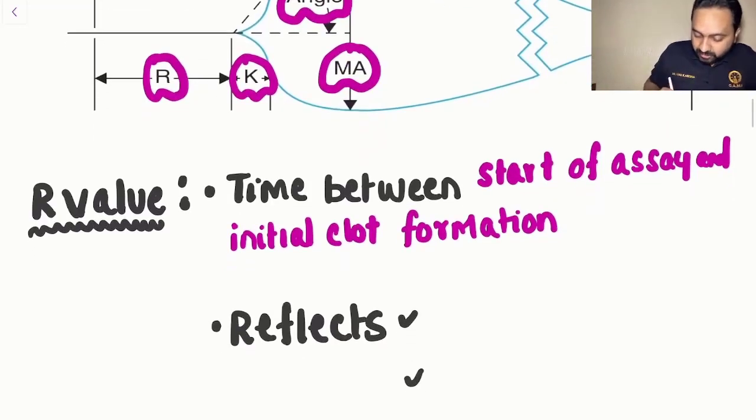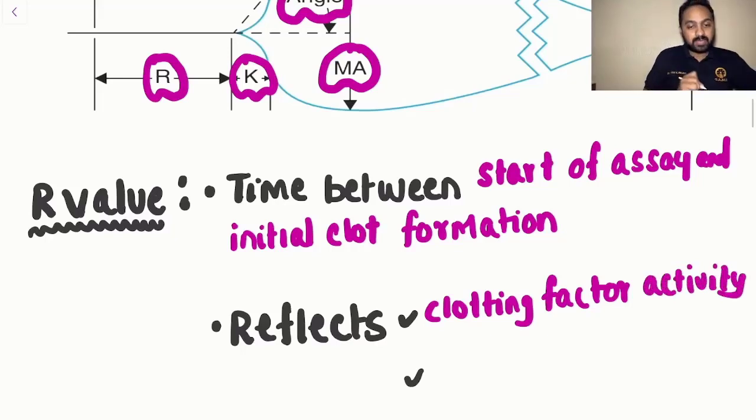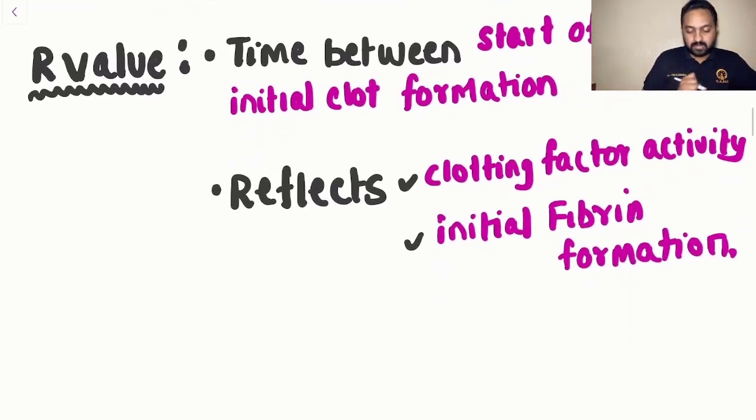So what does it reflect? It reflects your clotting factor activity and your initial fibrin formation. Right.